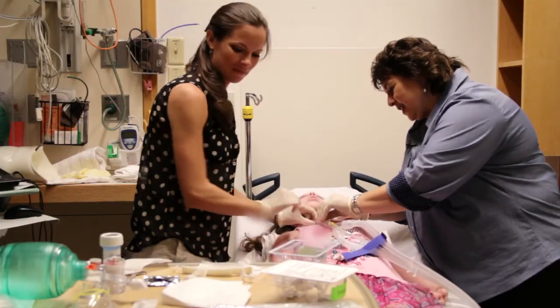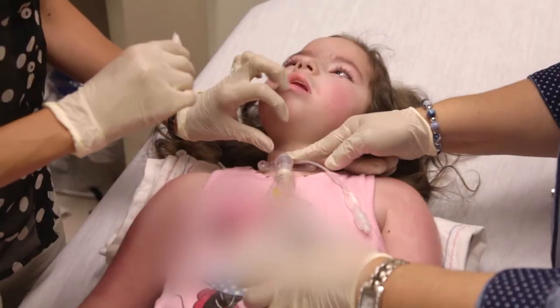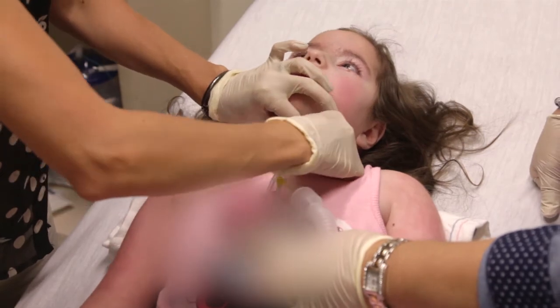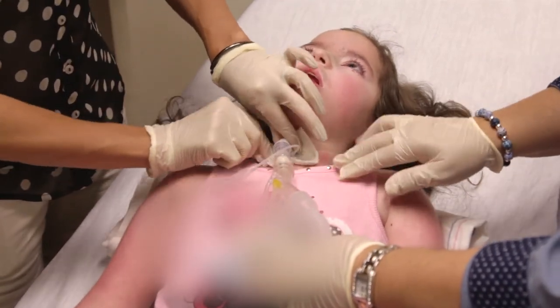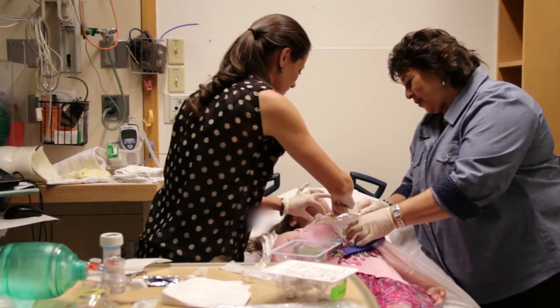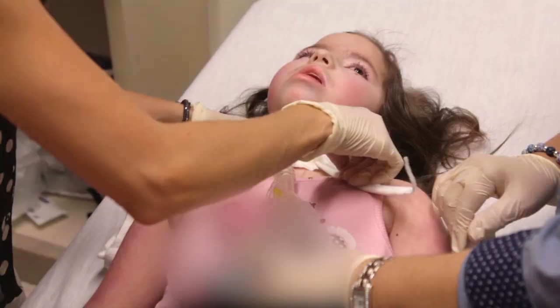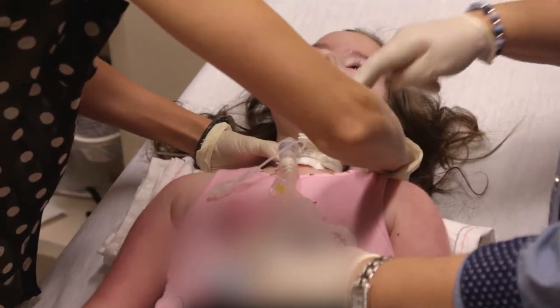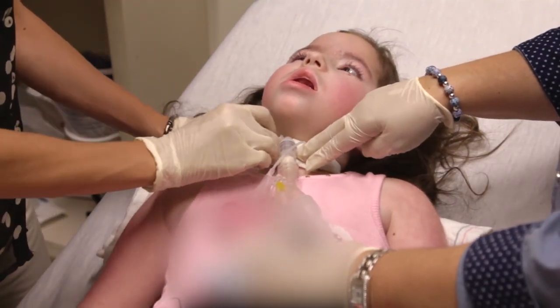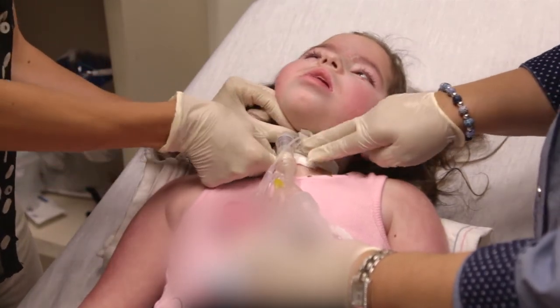Wonderful, sweetheart, we're all done. I'm going to hold the tube in place so that her mom can get the dressing ready. Good girl. We see that she's as comfortable as she has been the whole time she's been here. Her heart rate and oxygen saturation are normal. She is glowing pink from the additional oxygen, most likely. And we do have our stethoscope so that we can assure placement as well.